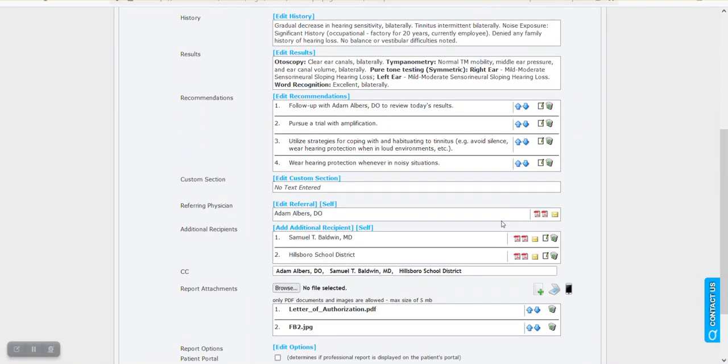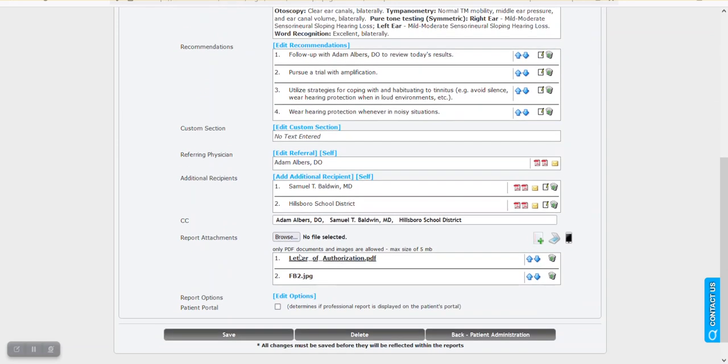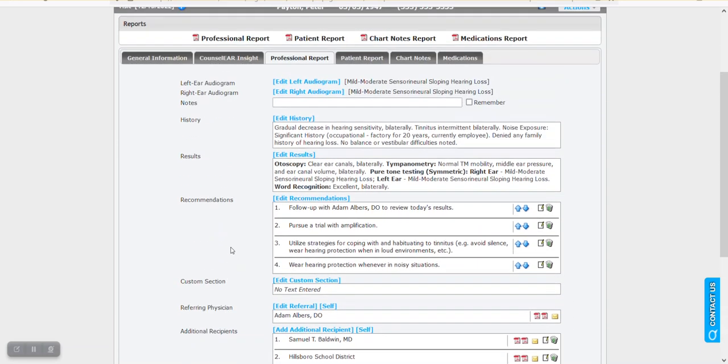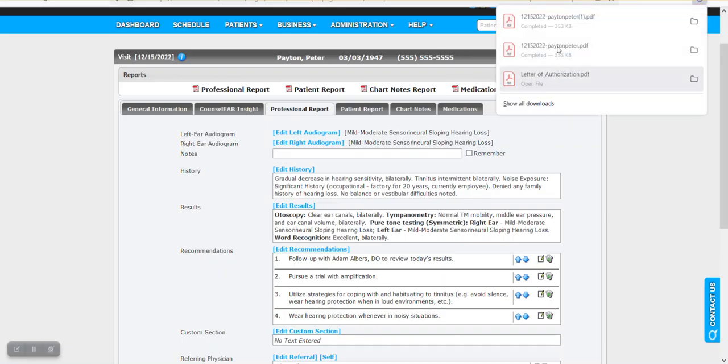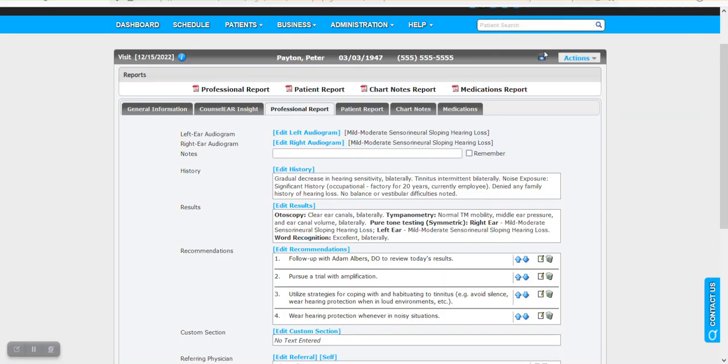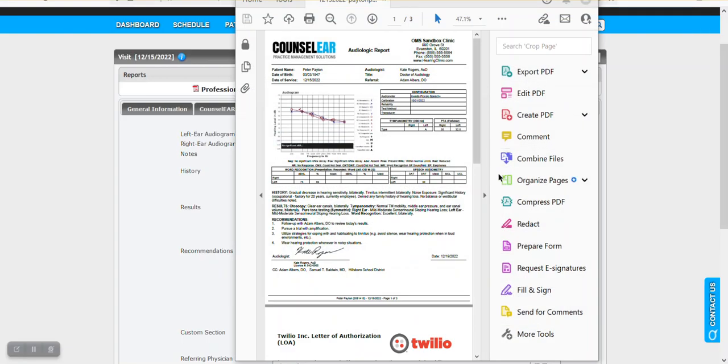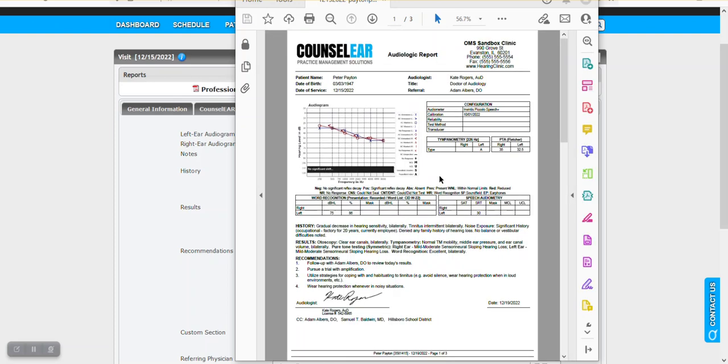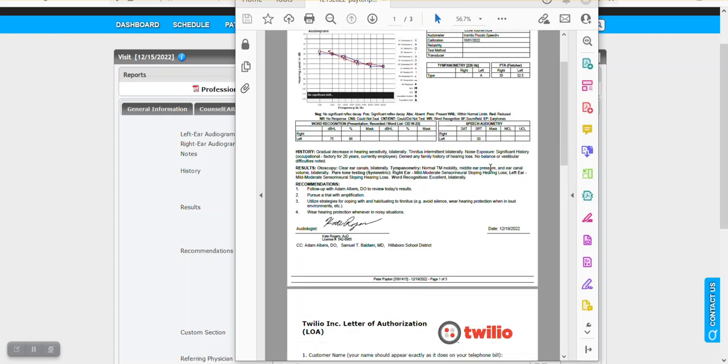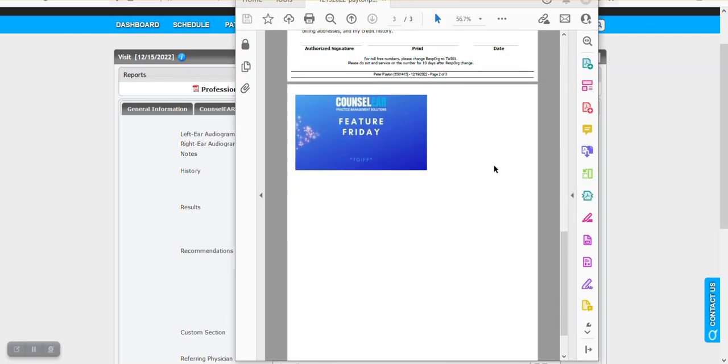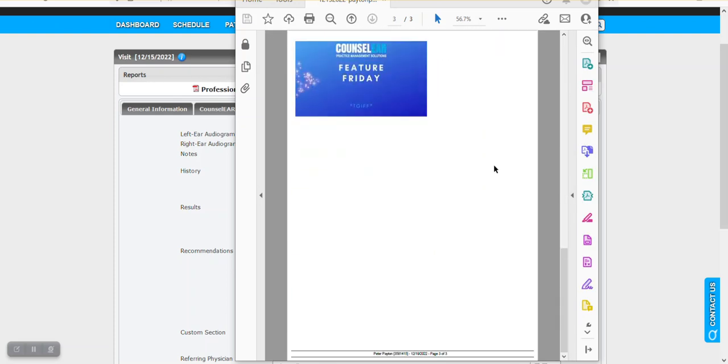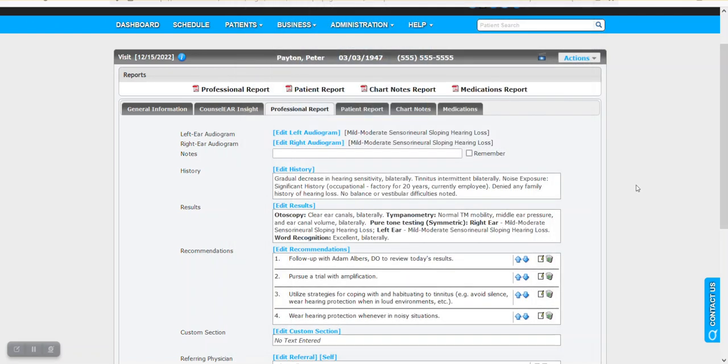And just like that, we have now added both of those images or attachments. And then if we look at the Professional Report, we will see what that looks like. So here we go. Here is our Professional Report. There is our first attachment and there is the image that we attached. So it makes it really easy to get the attachments added, even if you already have them stored within the patient document section.